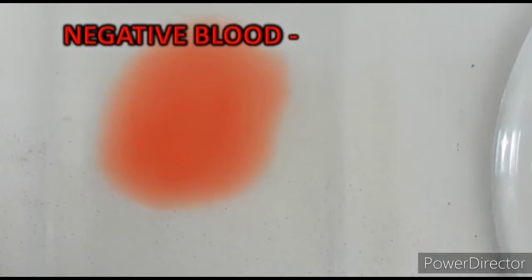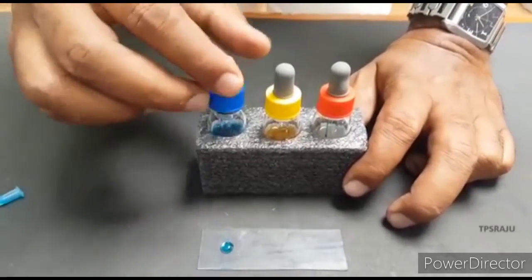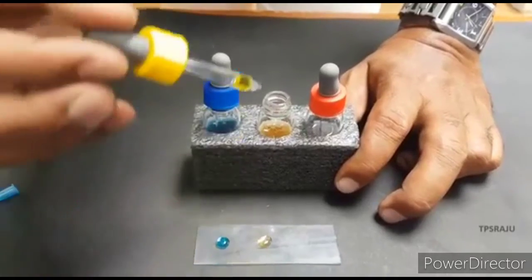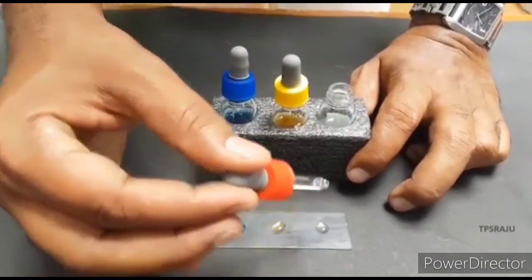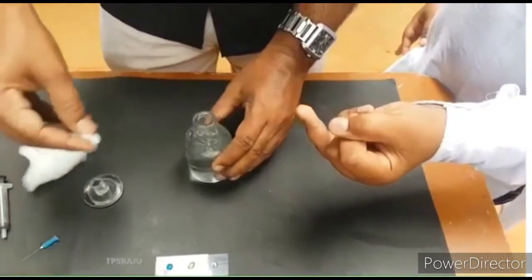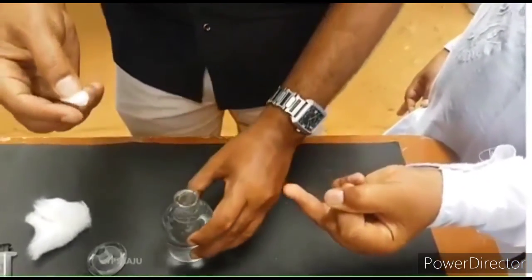Now let's identify the blood group for one person. For this we have to take one slide and take 3 drops respectively from the 3 bottles, anti-A, anti-B and anti-D. Select one finger and sterilize the finger using a cotton pad. We have to use alcohol or clinical spirit for that. Let it dry.